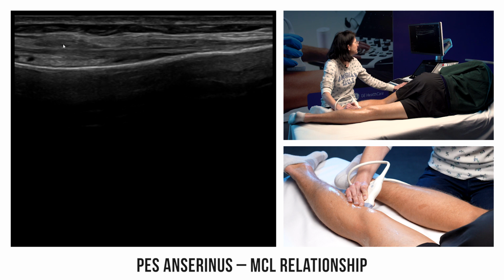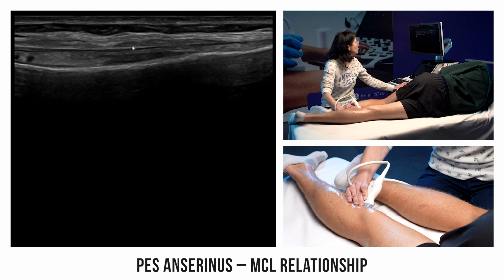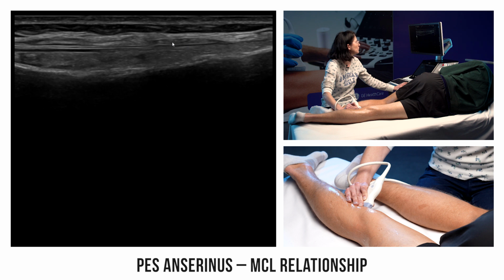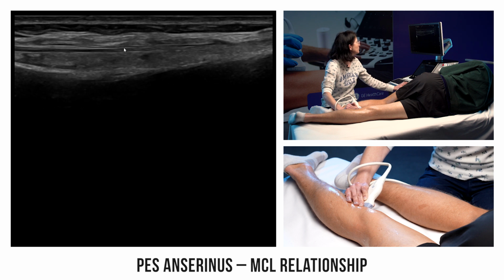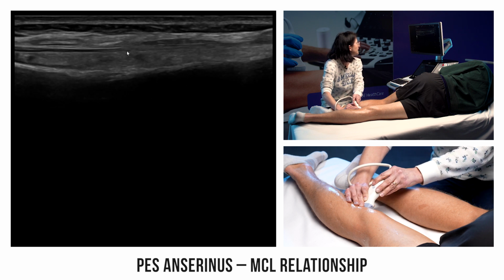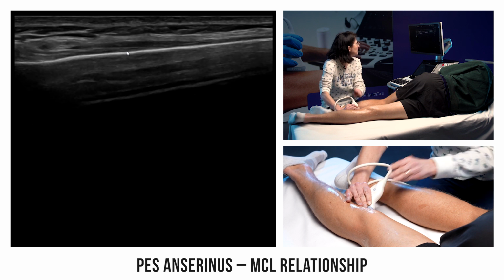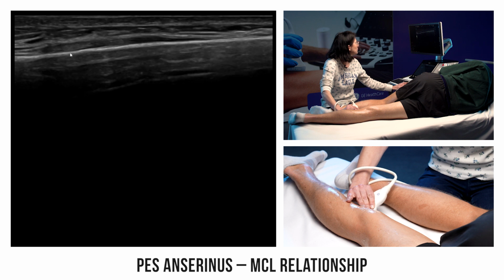closely near the surface, we can make out these oval structures with the lower two being more or less coalescent. Here above the sartorius, since given the angulation, the tendon that was the most anterior, the sartorius, becomes superior, the gracilis stays in the middle, and the tendon that was the most posterior becomes inferior. This is the semitendinosus. Here, they are located above the medial collateral ligament. If we shift the probe towards the front, we leave the medial collateral ligament and arrive on the insertion of the pes anserinus tendon here.